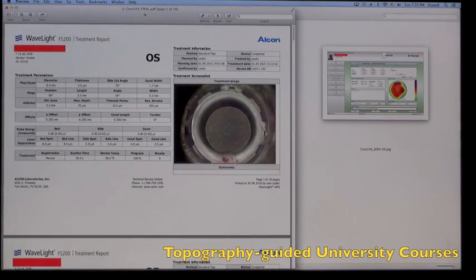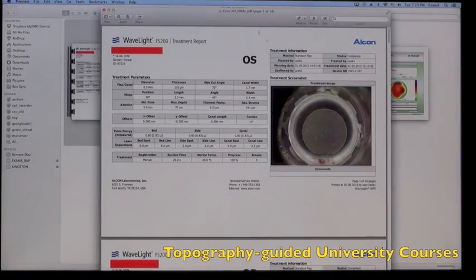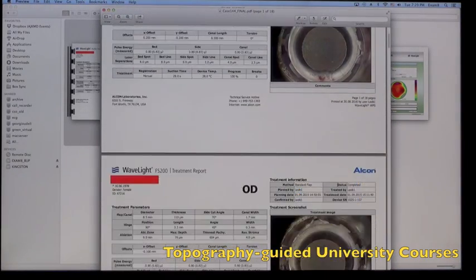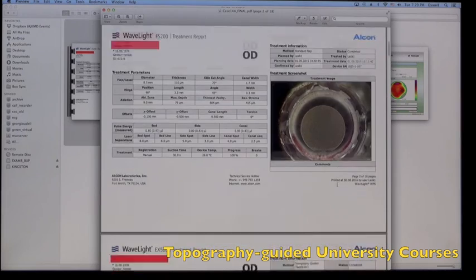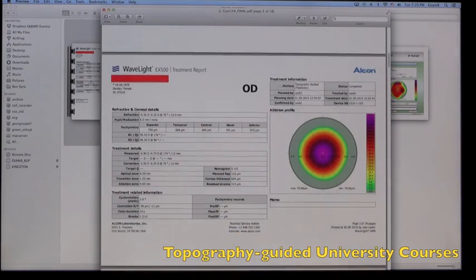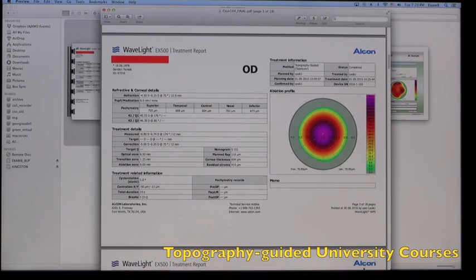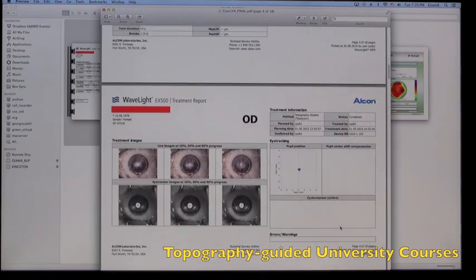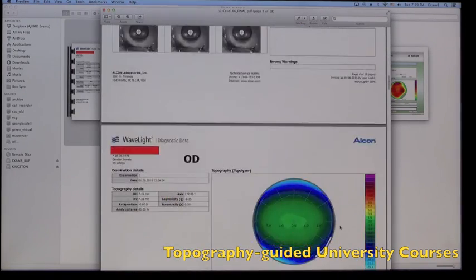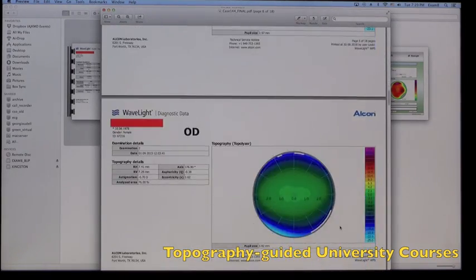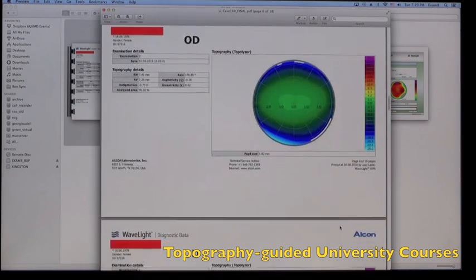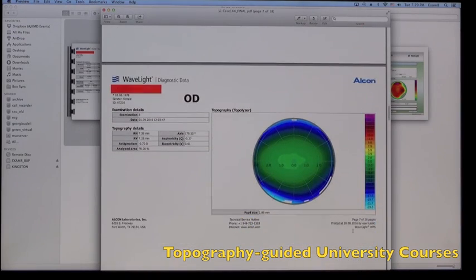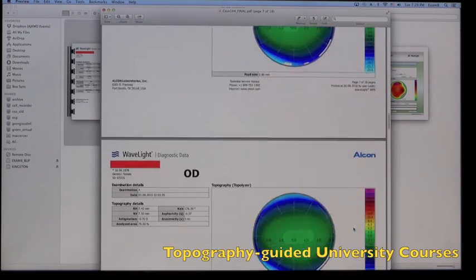And you can see if we scroll down this PDF, what was the final refraction, the flaps created, and the final refraction treated in this patient, left and right eye. And also some cyclorotation tracking data that you can see at the end of the procedure.